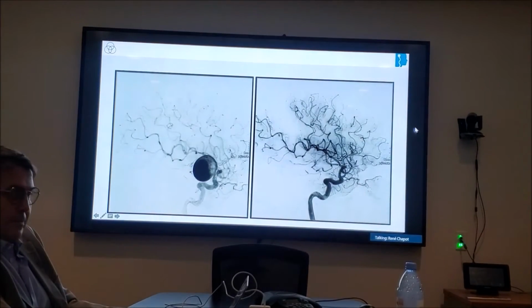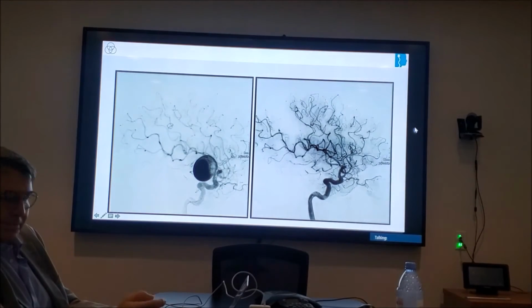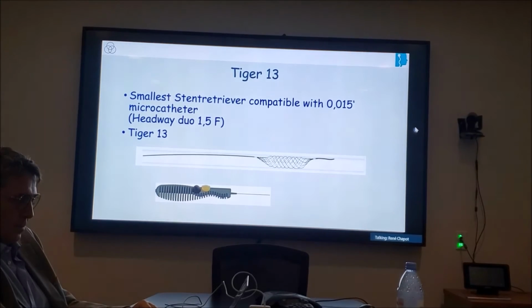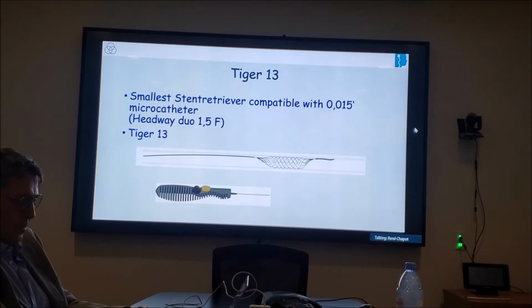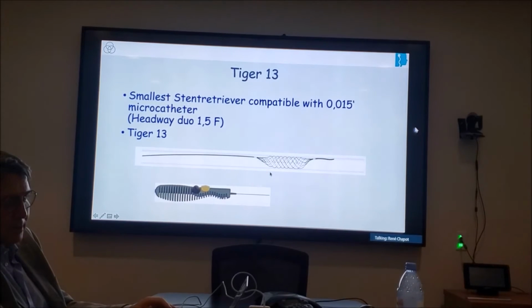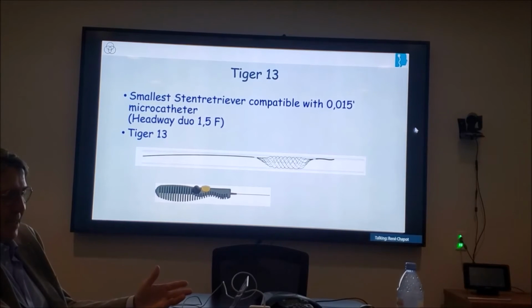Here's an example. Do you guys understand that? Yes. This is like a nitinol balloon, if you will. So what he's saying, do they handle them? They think if you click it just a little bit, you can only open half of it. So it's not like an automatic device. And even when you try to open it completely in a small vessel, it won't, but still you adapt to the size of the artery, so it makes sense.